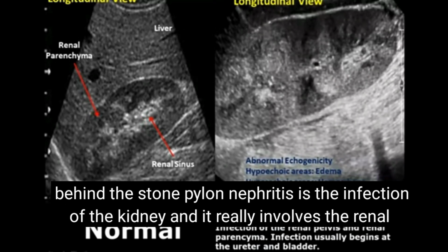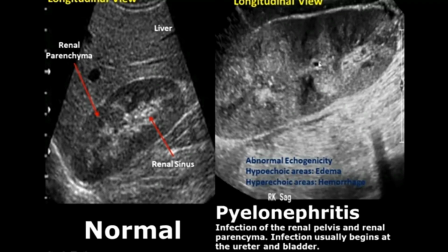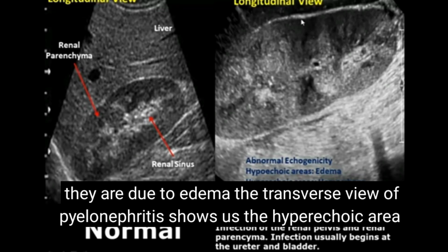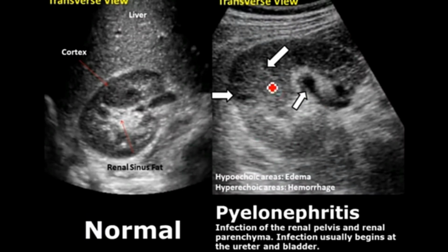Pyelonephritis is an infection of the kidney and it involves the renal pelvis and the renal parenchyma, and it can cause abnormal echogenicity in the kidneys. The regions that are hyperechoic are due to hemorrhage, and the regions that are hypoechoic are due to edema.